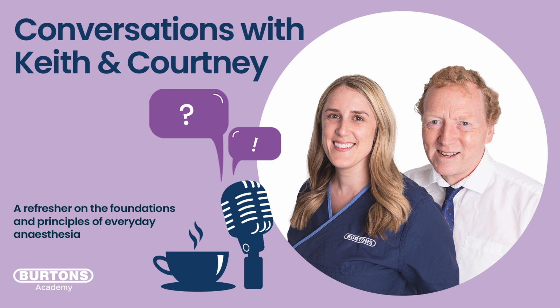Yeah. So if you have, say, a packed cell volume of 30%, PCV is 30%. So you've got plenty of red blood cells in there, and they're all 97% saturated. Then obviously you can infer from that it's able to carry a lot of oxygen. But say your PCV was 18%, all the ones that are there are going to be 97% saturated. So they're still going to give you a nice percentage on your pulse ox, with a carrying capacity of that 18% PCV compared to 30% way, way down, because you've just got fewer red blood cells.